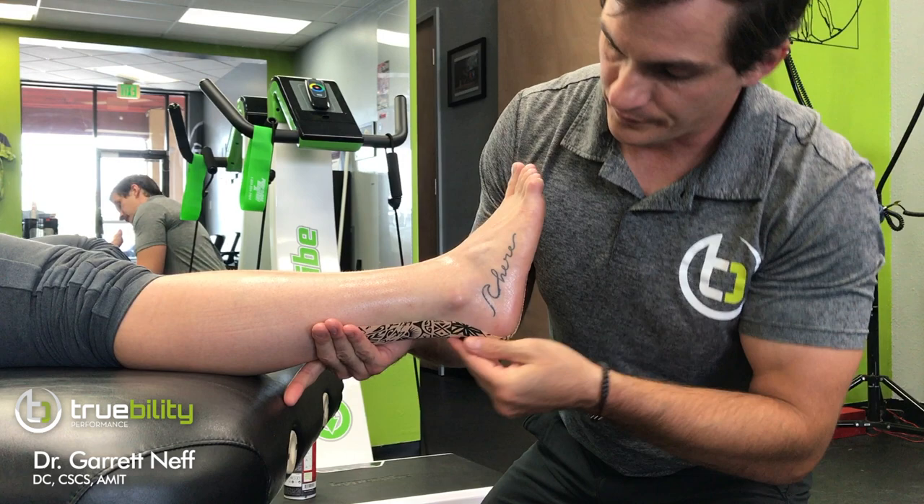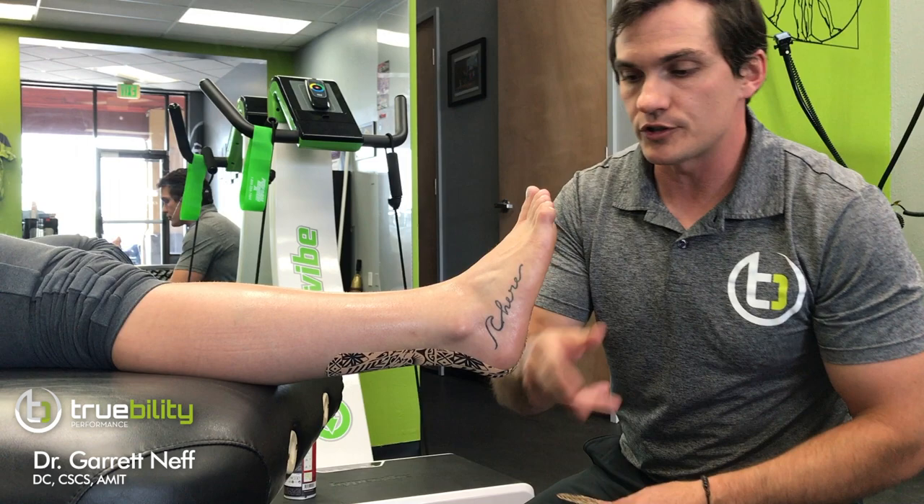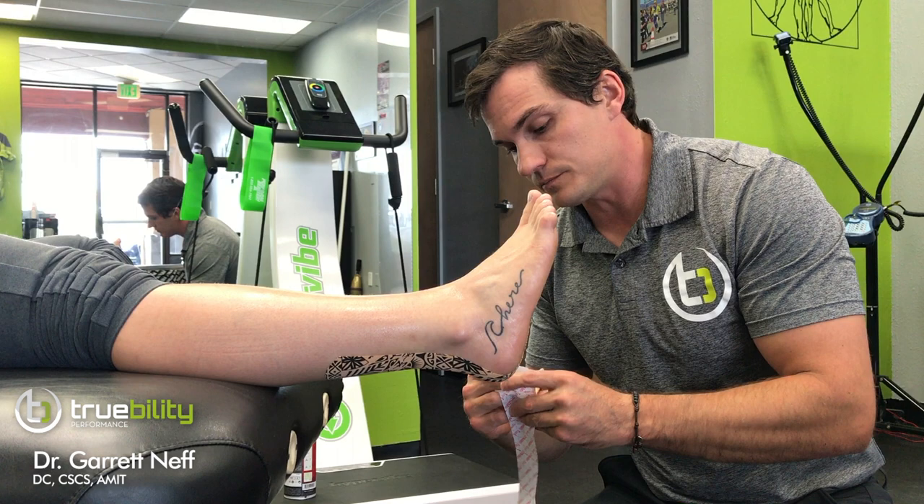If you wanted to, you could run the tape into the toes to get the whole fascia line, or run it further up the calf. However you choose to do that, the next portion is what's really neat — and we learned this through dynamic tape.